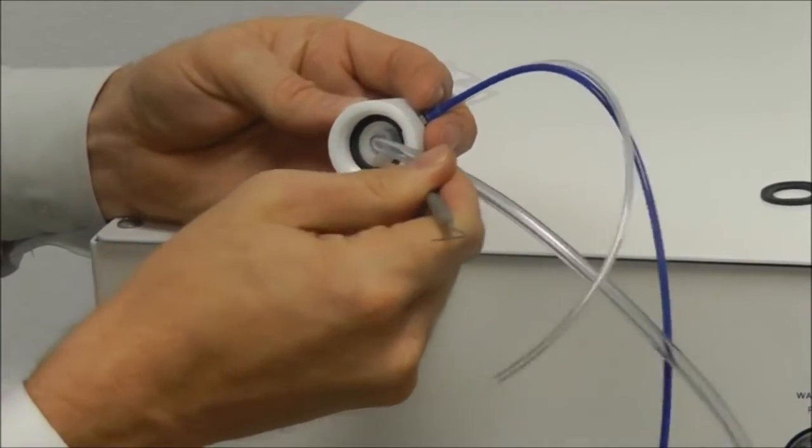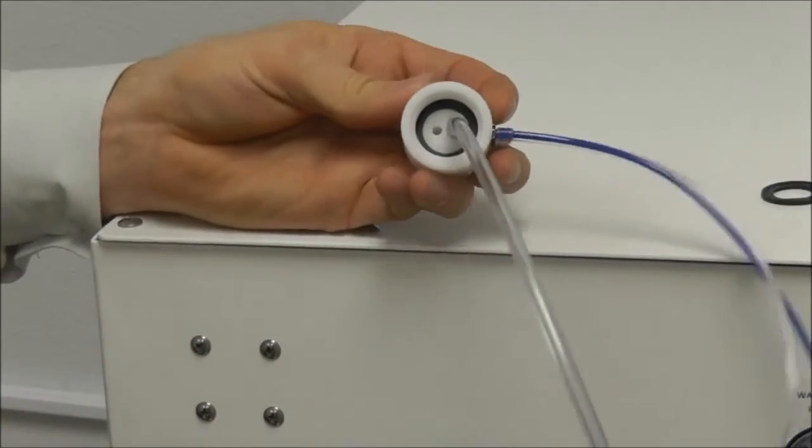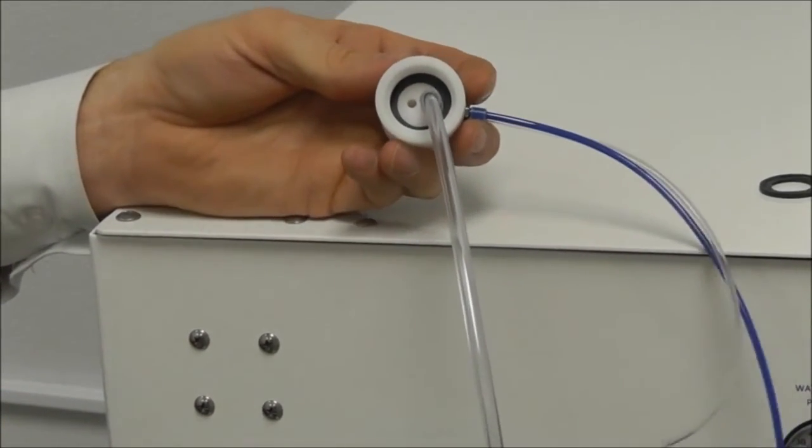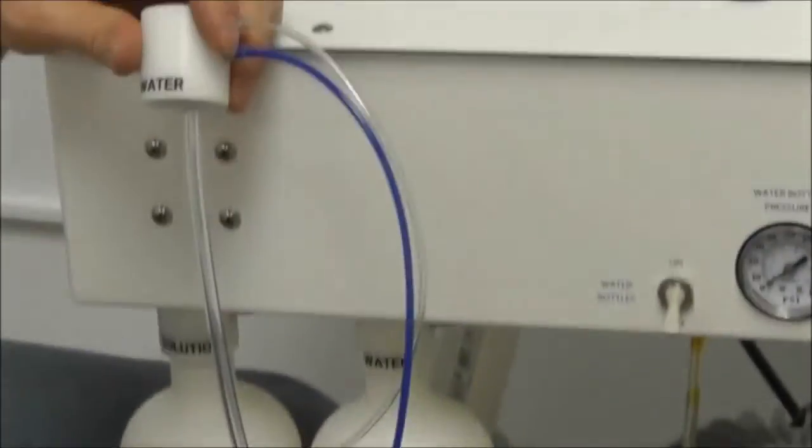And getting it seated very nicely down in there, just like so. Then you'd replace the water bottle back onto this threaded hookup, and away you go.